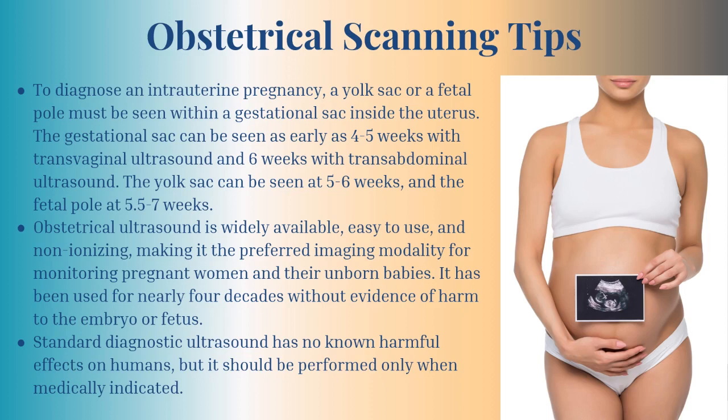Obstetrical ultrasound is widely available, easy to use, and non-ionizing, making it the preferred imaging modality for monitoring pregnant women and their unborn babies. It has been used for nearly 4 decades without evidence of harm to the embryo or fetus. Standard diagnostic ultrasound has no known harmful effects on humans, but it should be performed only when medically indicated.